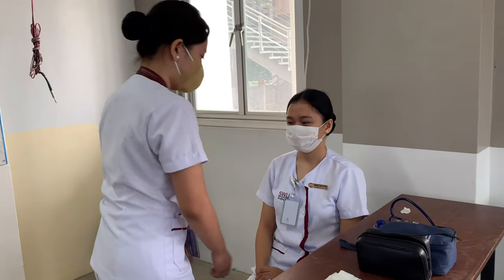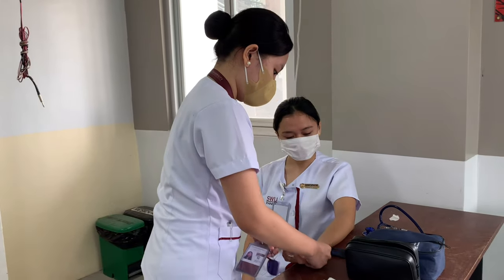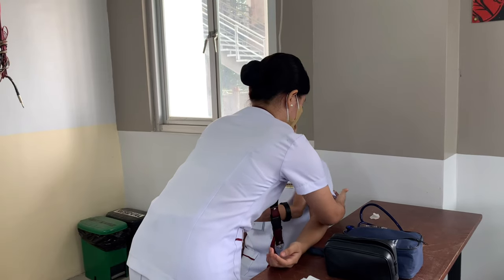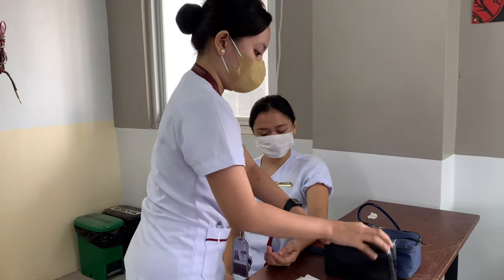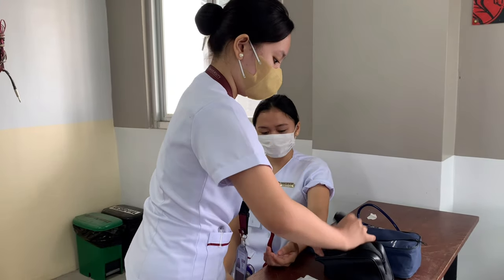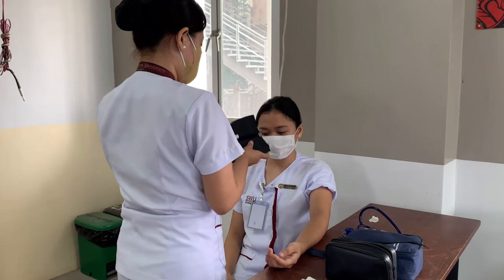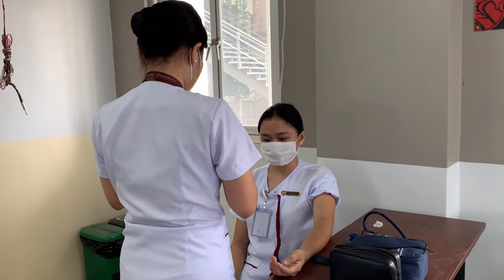In taking the blood pressure, assist the patient to assume a correct position. This promotes patient comfort and relaxation. Remove or rearrange clothing to expose the area where the cuff will be applied — this is to avoid any disturbance while taking blood pressure. Extend the arms with the palm facing upward. Place the cuff approximately one to two inches above the inner aspects of the elbow with the bladder over the brachial artery.